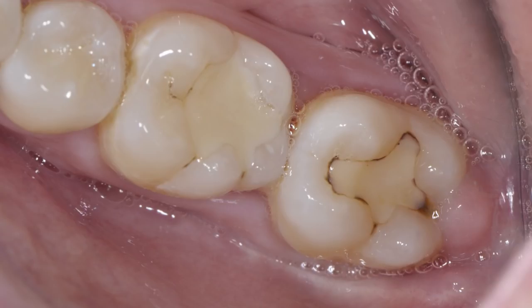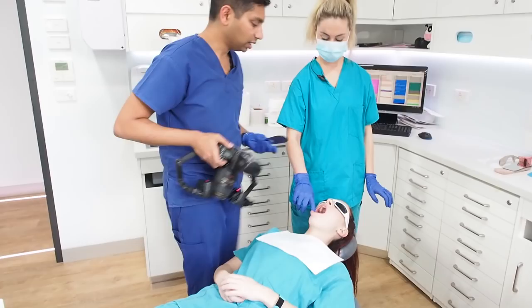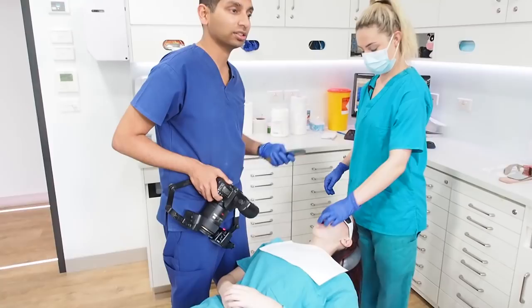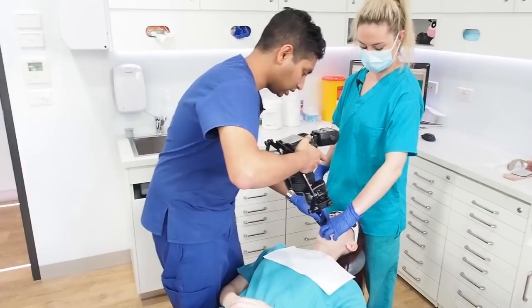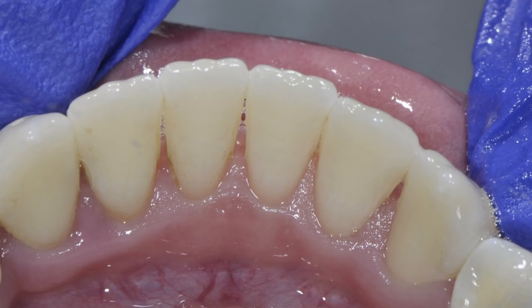Now I'll take one behind the lower front teeth. That's a good one to take to show patients calculus buildup or bacterial buildup around their teeth. That mirror just sits right near the tongue — sideways is probably the best way to position it.